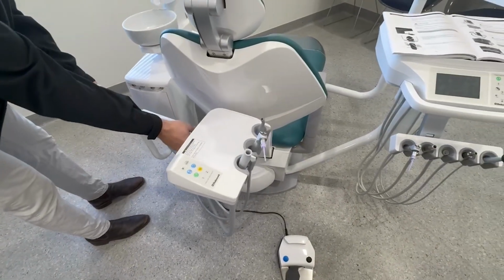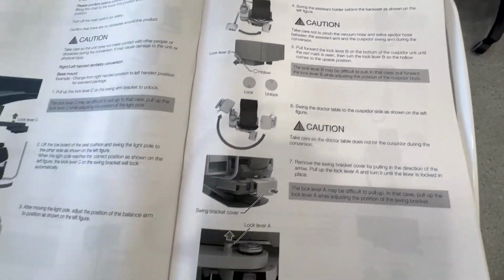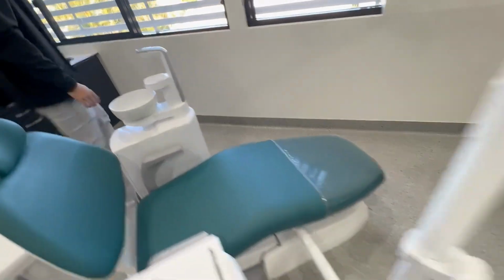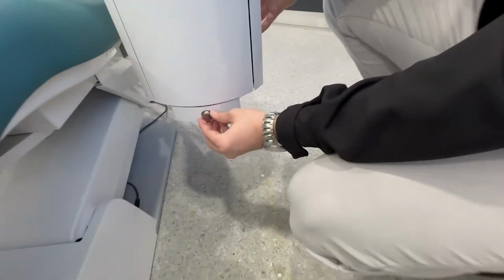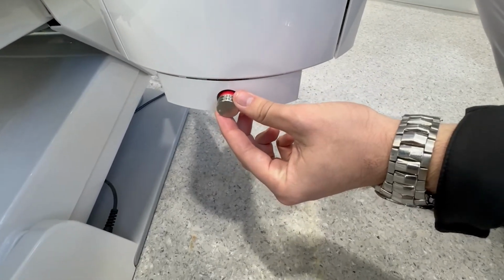We move it in tight in there. Now what we're trying to do is create a nice flow for our doctor's arm to be able to move past. Then we've got a little pin on here, down on our arm. So let's have a look where that pin is. There's a pin down here, we just pull out. It pulls out and then we can rotate it a little bit and it'll stay out, yeah? And then when we're finished, we can rotate it and it'll drop back in.